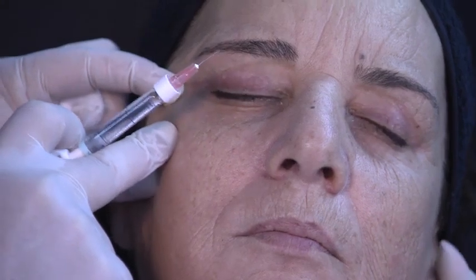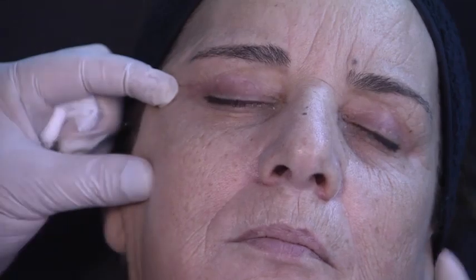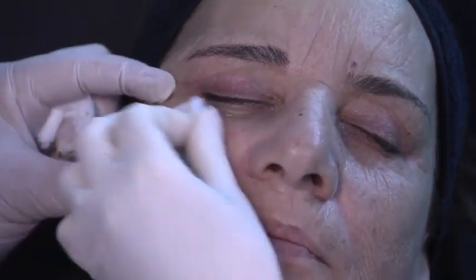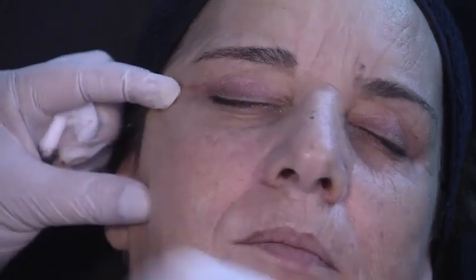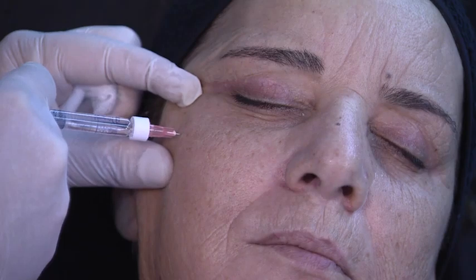So first point, zygomatic point again. I palpated the indentation that we highlighted before. Because I have touched with my glove now, I want Victoria to clean the entry point again. Look, disinfection is crucial. We go fast, we have a lot of patients waiting in the waiting room, but you really need to be careful with the disinfection. Now I touch the bone, and not even all my needle is in.